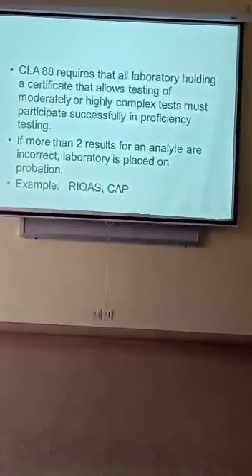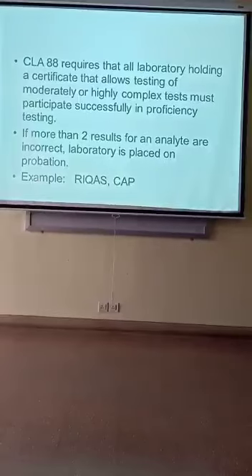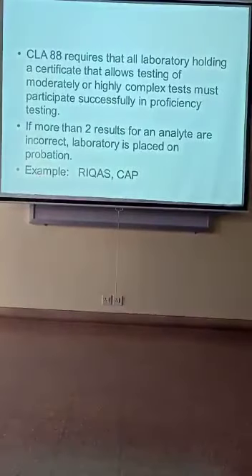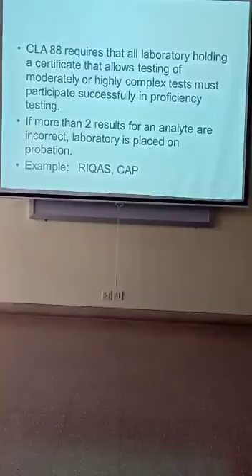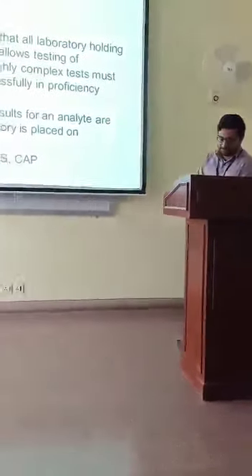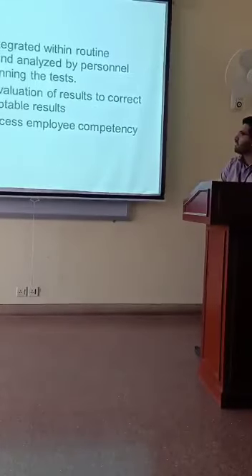Further, CLIA 88 requires that all laboratories holding a certificate that allows testing of moderately or highly complex tests must participate successfully in proficiency testing. If more than 2 results for an analyte are incorrect, the laboratory is placed on probation. The external quality control programs include RIQAS and CAP. CAP is the College of American Pathologists.